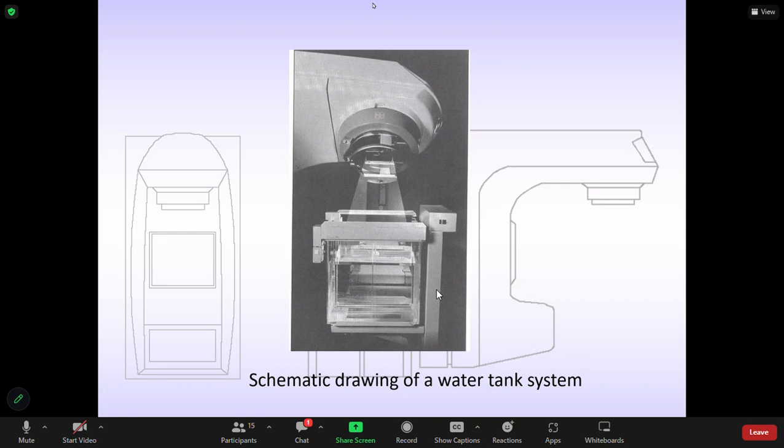So what I recommend, as a physicist, if you need to repair the machine in a way that requires measurement, is to first establish a baseline. You use your profiler and take measurements and save them, okay? Then you do the repair, and after you do the repair, you measure again and compare.